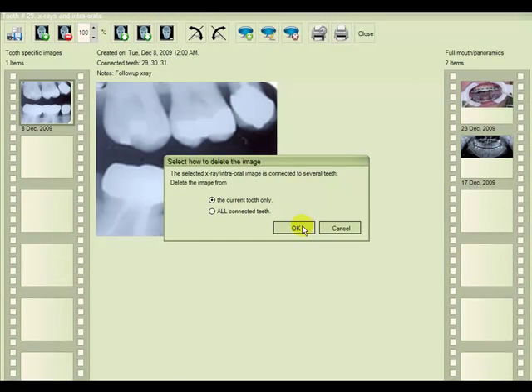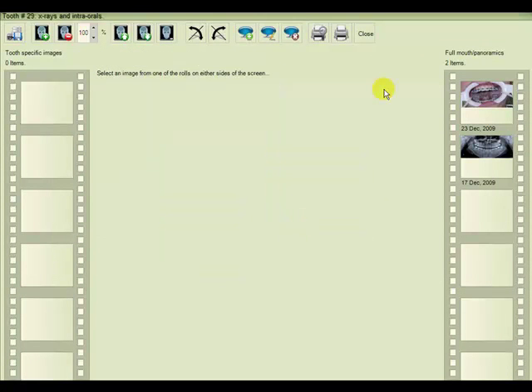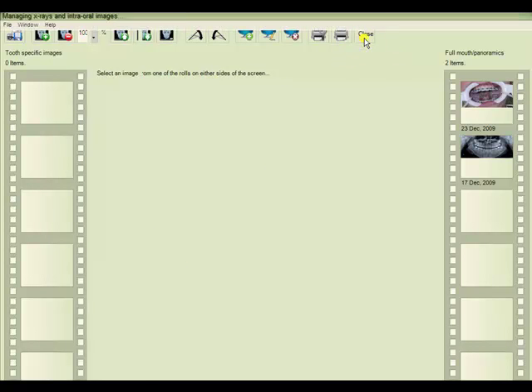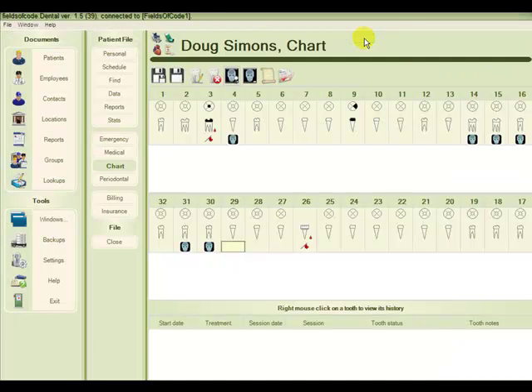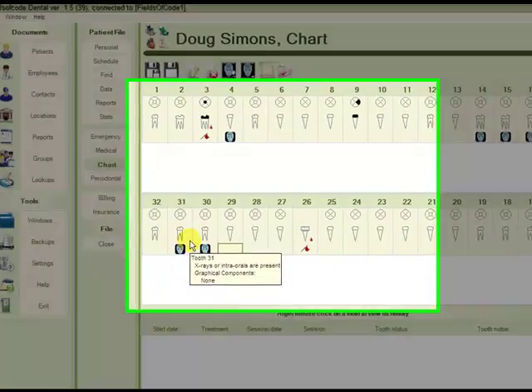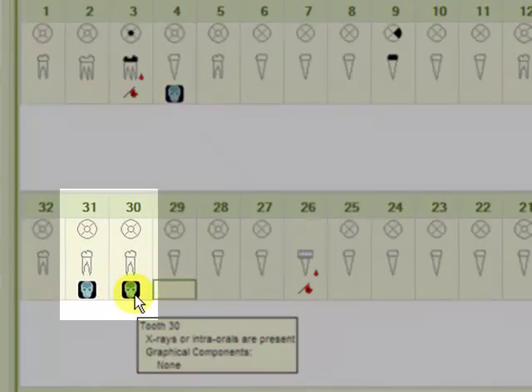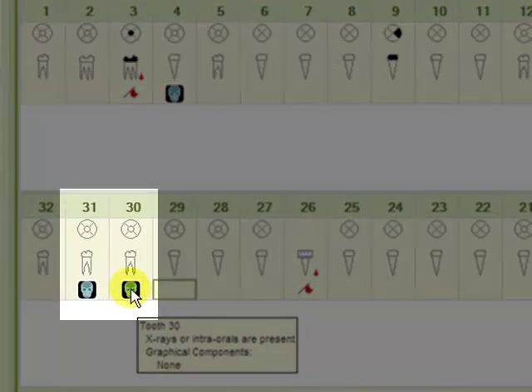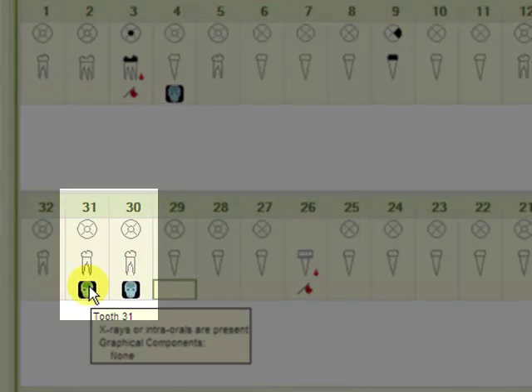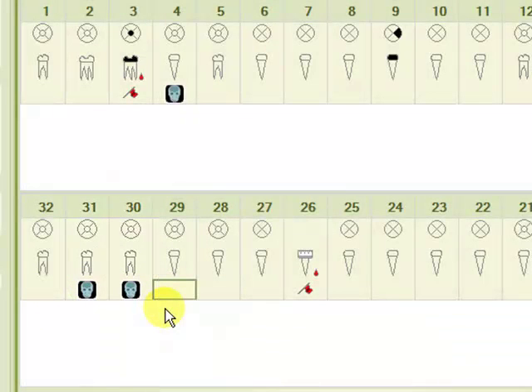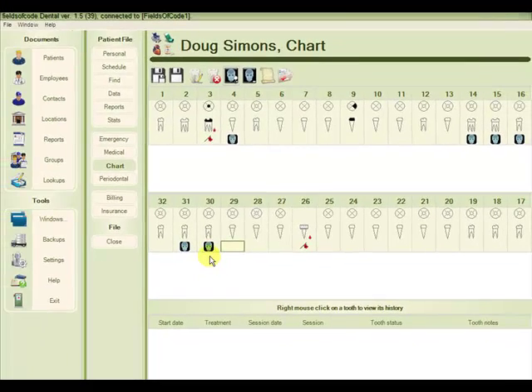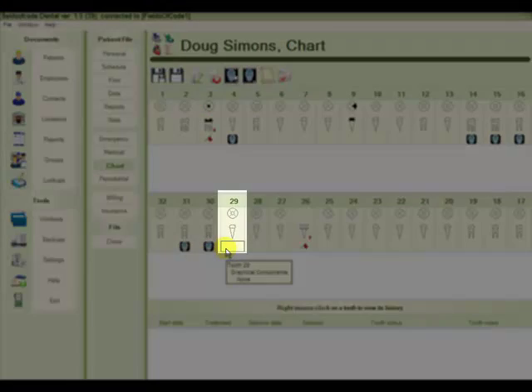So we'll choose the current tooth only and now the X-ray has been deleted from this tooth. If we close the dialog box, we see that the X-ray is still linked to tooth 30 and 31. So although that X-ray still exists in our database, because it is linked to 30 and 31, it no longer shows up on tooth number 29.